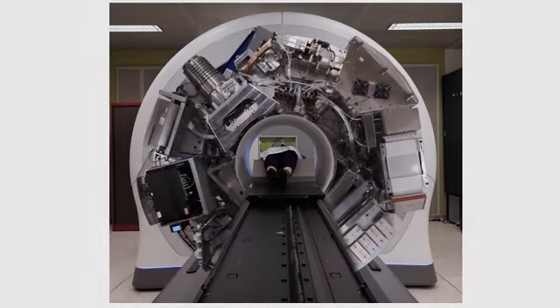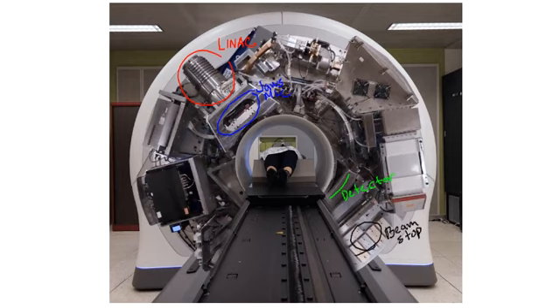Let's pause and take a look at this. So you've got a linac here. You'll note it's really small. It's a very small linac. There's the jaws and the collimators. I'll explain in a minute. Down here there's a detector that allows for imaging. And then finally there's a beam stop down here that stops the beam, which reduces the shielding requirements in the room.